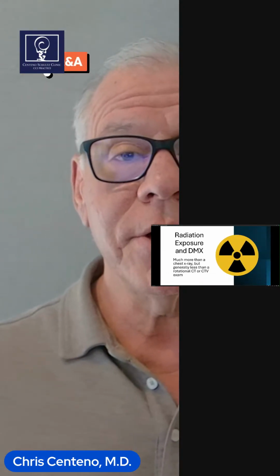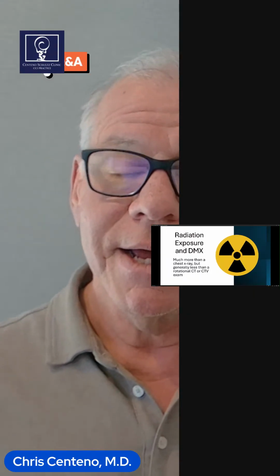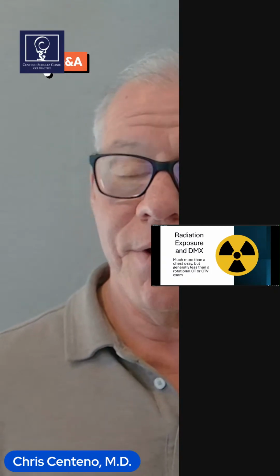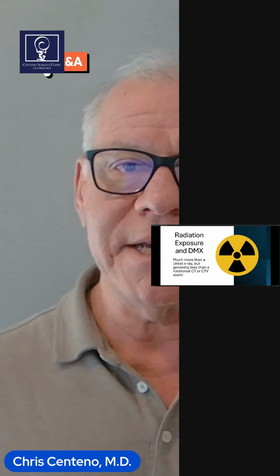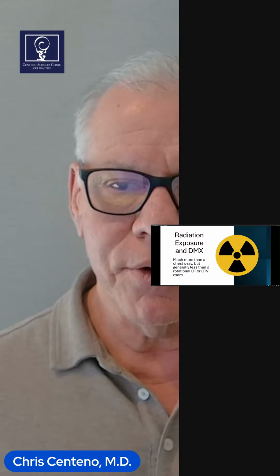Now, radiation exposure is also another question I get a lot about DMX. Well, how much radiation exposure is this? Now, sometimes these questions are nonsensical for me as a doctor, right? Patients already had a rotational CT scan and a CTV or CTA to look for IJV issues. So they've already had a lot more radiation exposure than you could ever get in a DMX. But other times, I think these questions are very valid, right? Are we really getting the most information out of a DMX for the radiation exposure that we are using? And the answer really is, honestly, that can be improved.